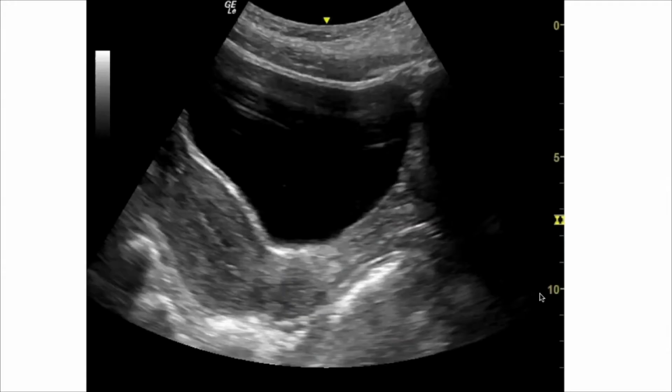So in this position, you can do an assessment of pelvic floor contractions, and then you can also transition that into a rehabilitative program where you have individuals contract in different positions, contract under load, contract with functional movements, and so you can assess how well the individual is able to contract those pelvic floor muscles in different uses.